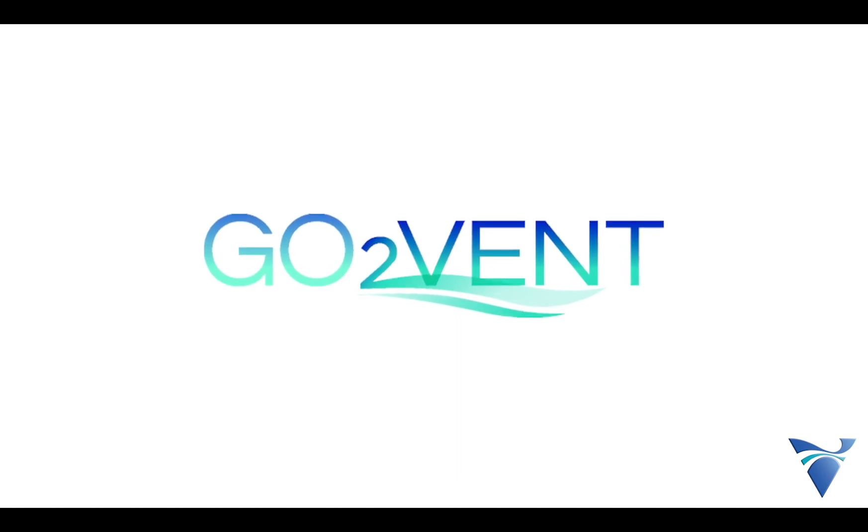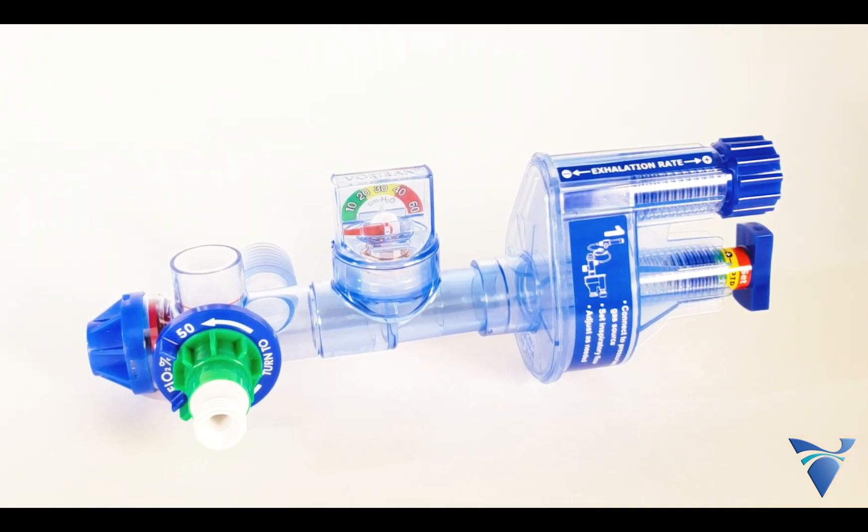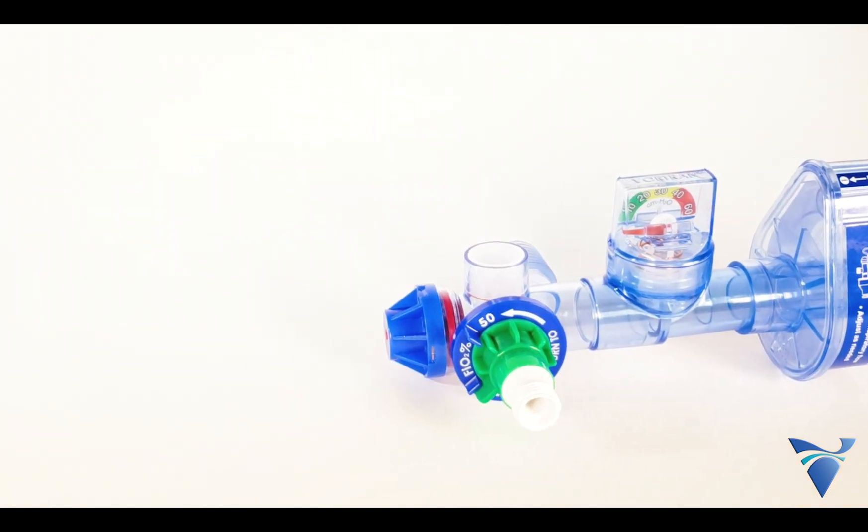Vortran presents the GO2VENT, an automatic gas-powered ventilator. The GO2VENT is the latest version of the Vortran automatic resuscitator, also known as the VAR.